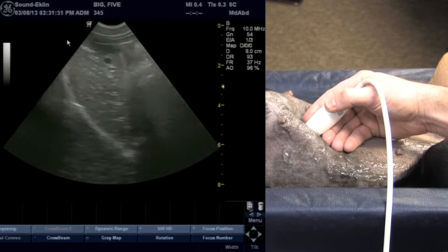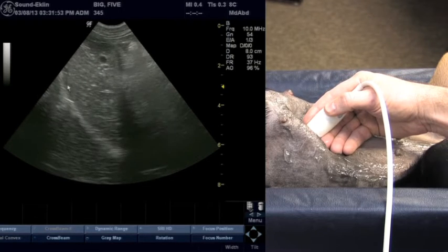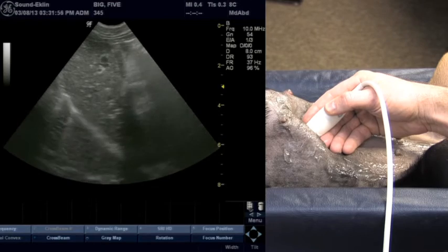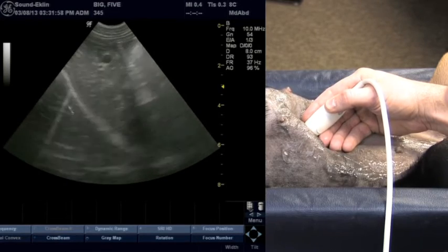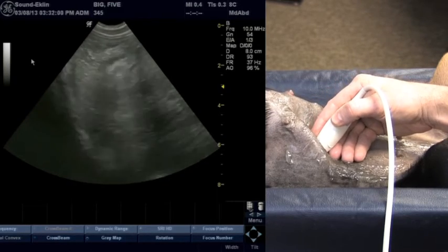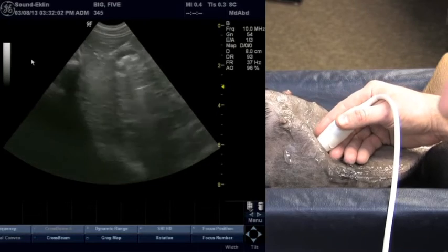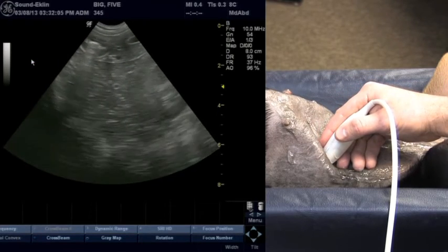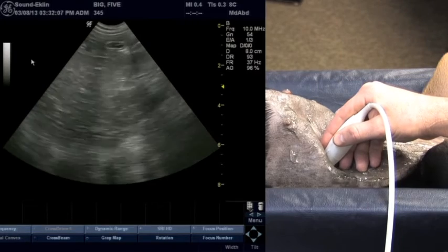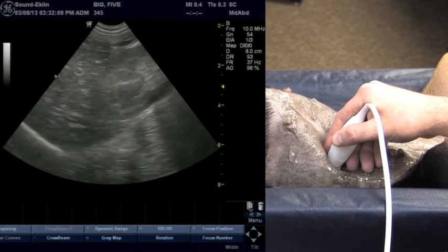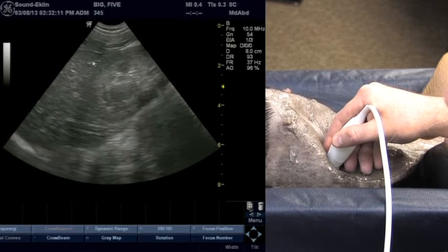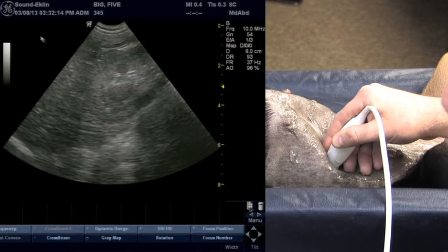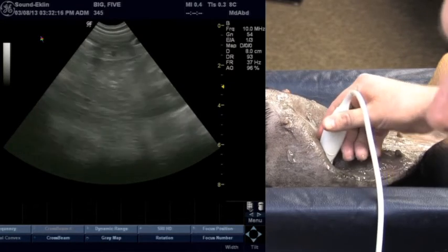We'll continue following the liver. This is the outline of where the lung and diaphragm come together, and down here is what we call a mirror image artifact. Continuing to scan along the right thoracic wall, my stopping point on the right side is typically when I can pick up both the kidney and the liver — we can see that kidney sitting in the renal fossa, which we'll come back to when we discuss kidneys.